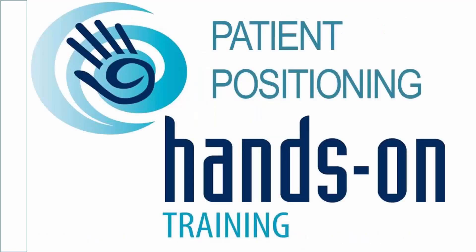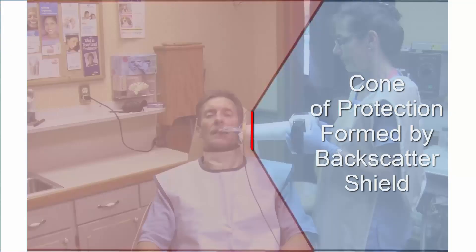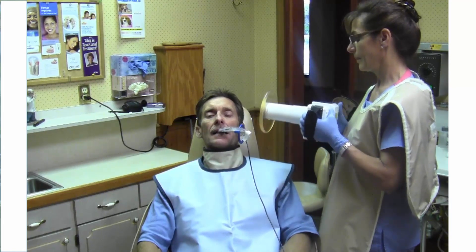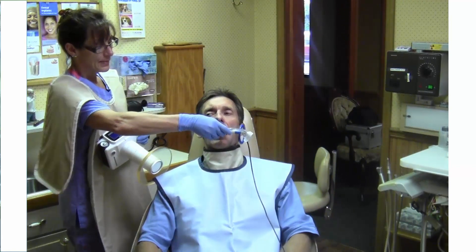We will now demonstrate how to position the patient. The most important thing to remember is to adjust the position of the patient for each X-ray view rather than the X-ray device. This keeps the backscatter shield parallel to the operator, allowing the operator to stay in the protection zone. If you need to use a sensor or film holder, we recommend you use one with a short bar that allows the backscatter shield to remain at the outer end of the cone.